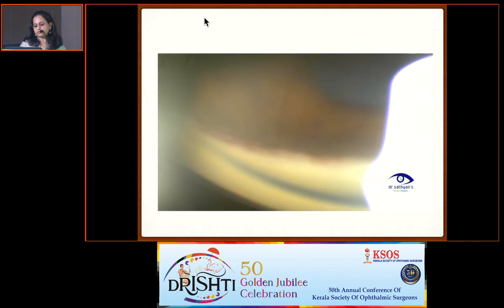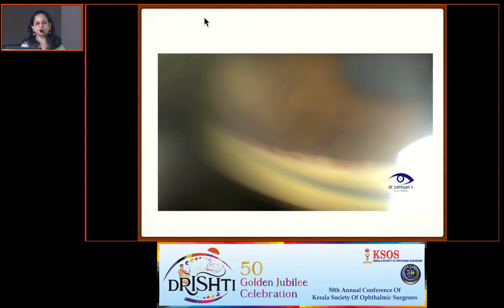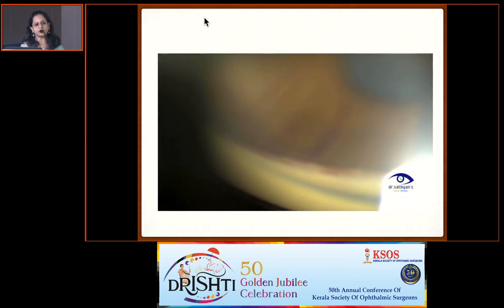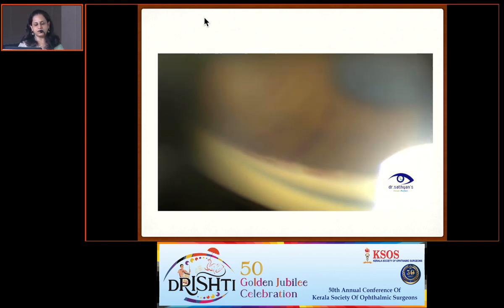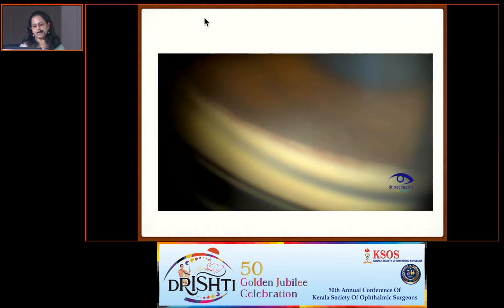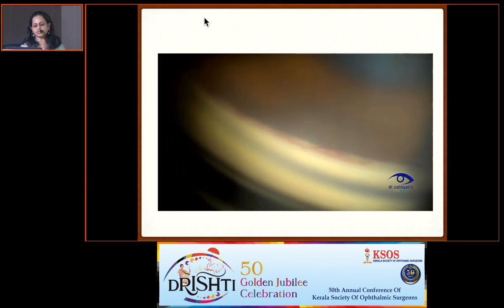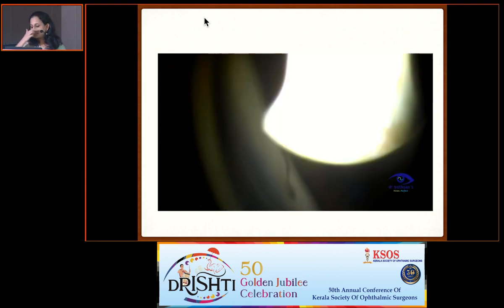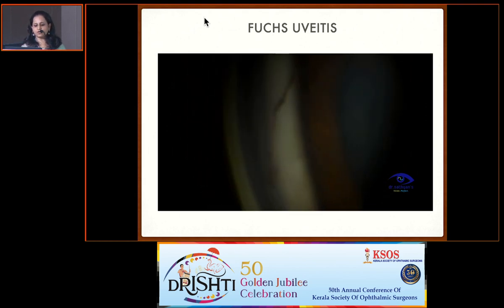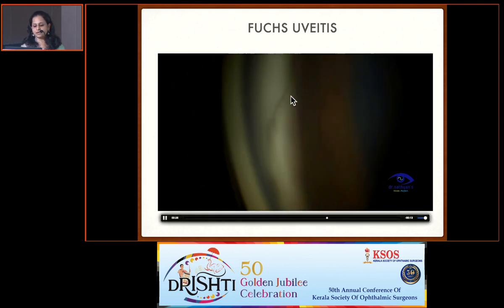And this was a video of a patient who came to us for cataract evaluation. On examination, the cornea had stellate keratic precipitates and endothelium. On doing gonioscopy, you can see that the angle had fine vessels, which actually started bleeding. So this is a case of Fuchs uveitis. The patient's IOP was normal. You can see the active blood that is coming here.